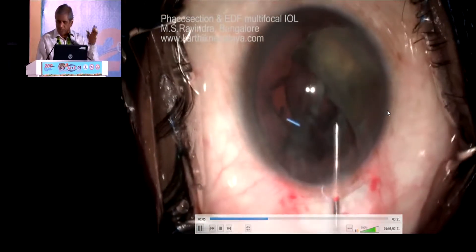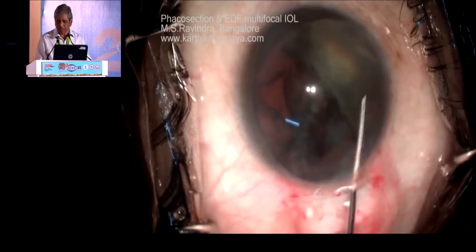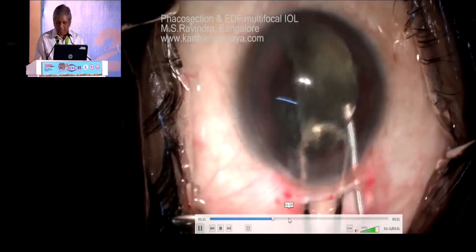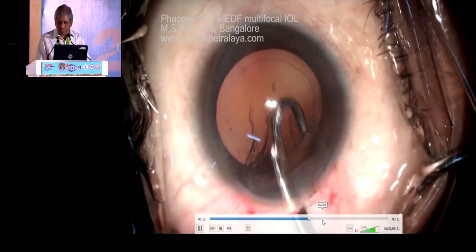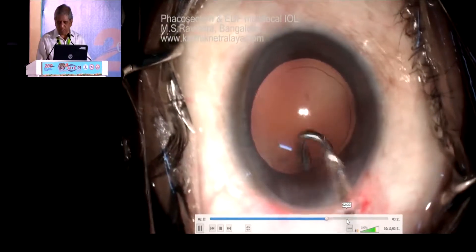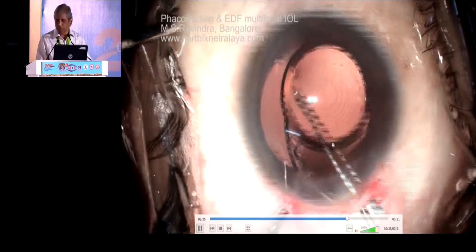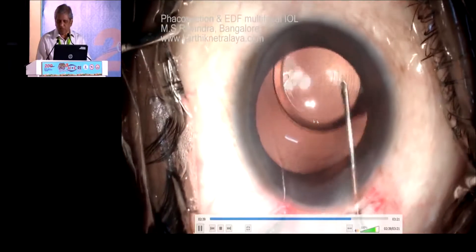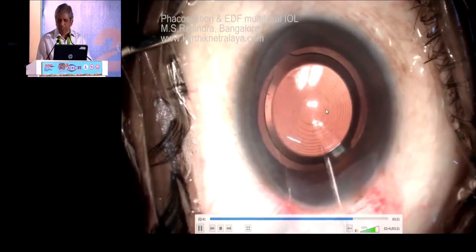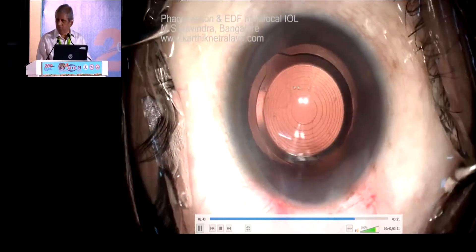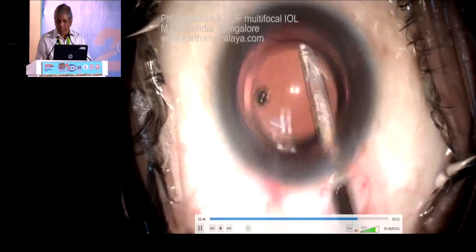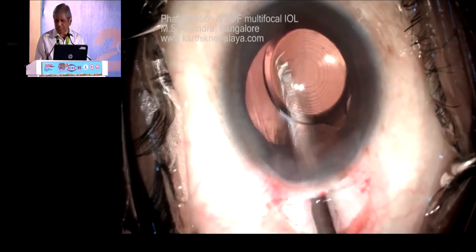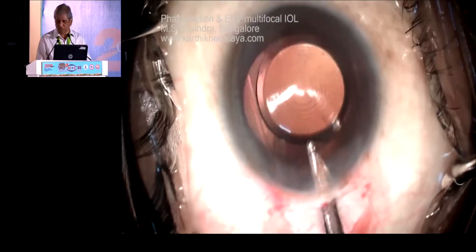Bisect it with the shaft of the cannula in all soft cataracts, and I am injecting viscoelastic continuously. At the end of it, I have got a good rhexis, and the patient wanted a multifocal lens. You can go and put a multifocal lens. What is important in a multifocal lens is not that you are putting it into the capsular bag — you should center it to the visual axis. Ask the patient to look at the source of light, and adjust the lens position. Wherever you want, it stays there, and probably stays there postoperatively also.